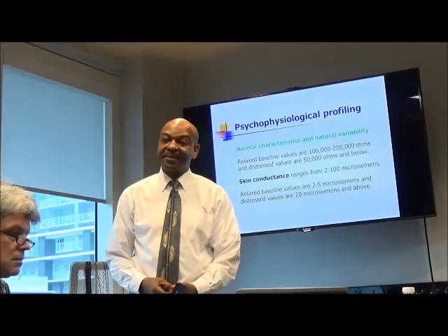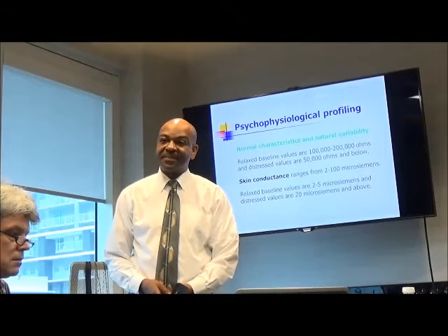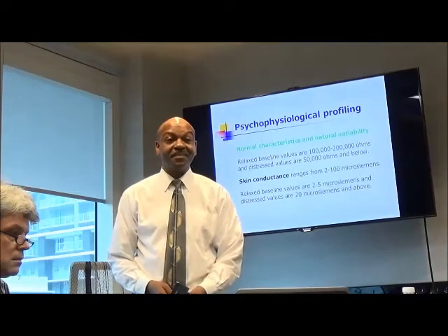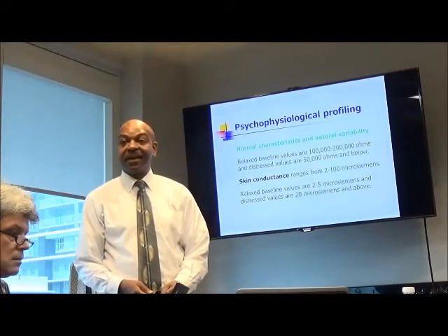She had all these dissociation problems, and the child used to live with that. So he was scared and stressed all the time, and that's the reason he had this measure. So you can have more than 100 and less than 2 microsiemens. Right.